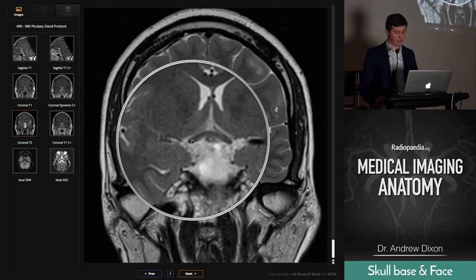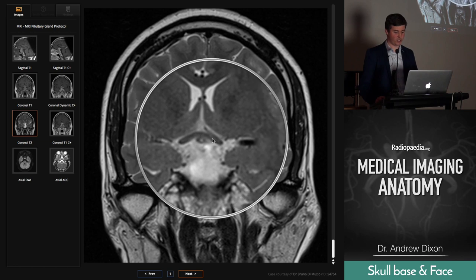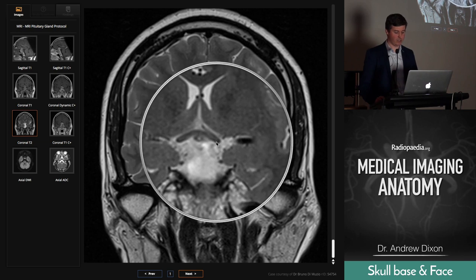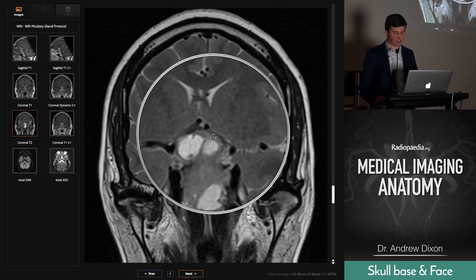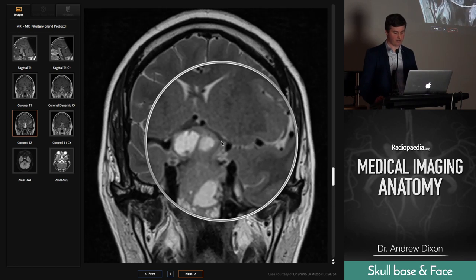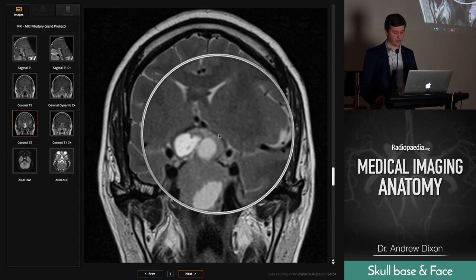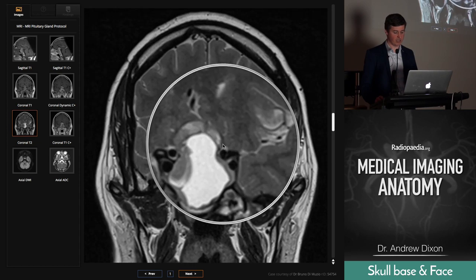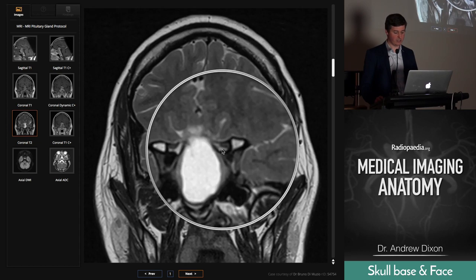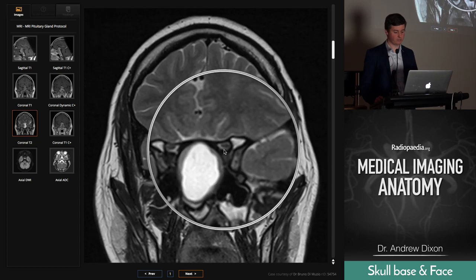Here's our optic chiasm getting pushed up, and as we run forward, just look how stretched out this nerve is as it's heading to try and get into the optic canal.